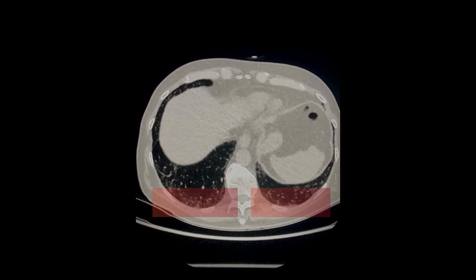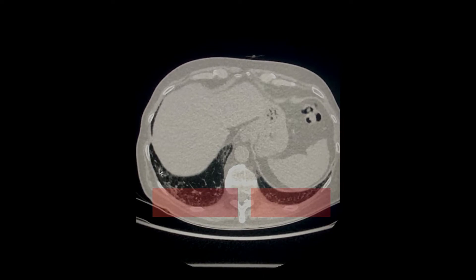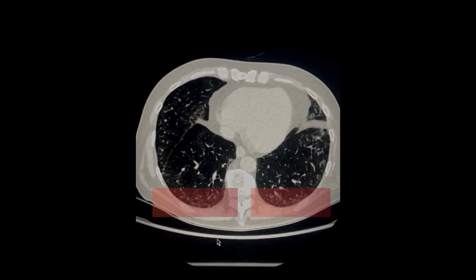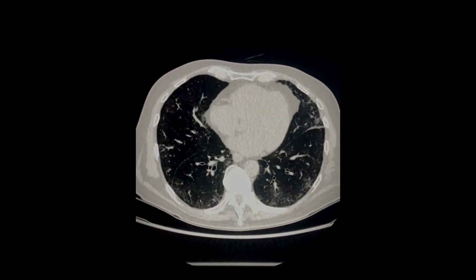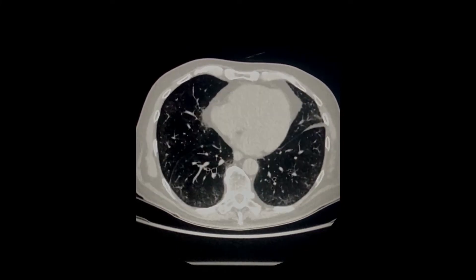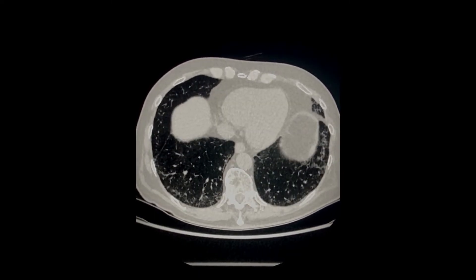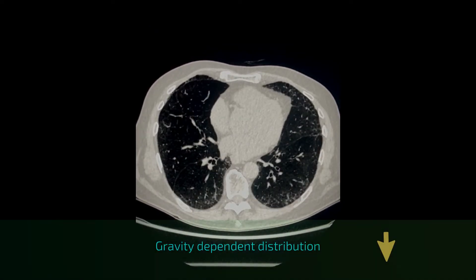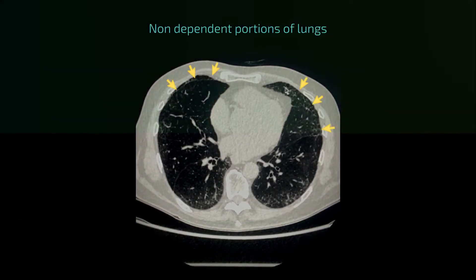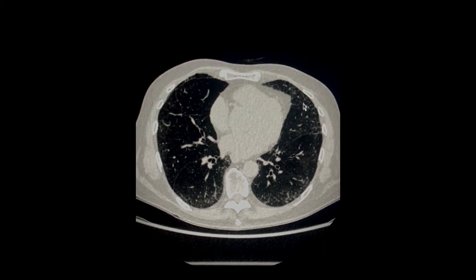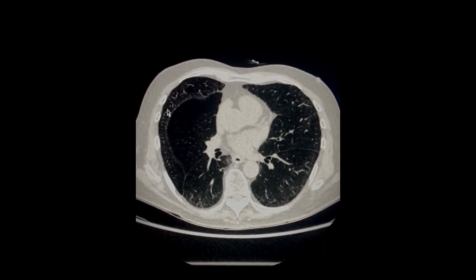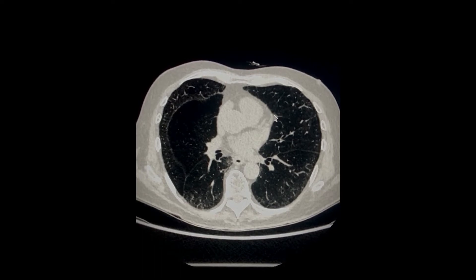If you look at this CT scan here, you would notice that the posterior basal regions have somewhat curved linear areas of atelectasis and some possible intervening ground glass changes. While this does have a gravity-dependent distribution, if you look at part of the non-dependent portions of the lungs, you can see that a similar process may affect these areas as well.